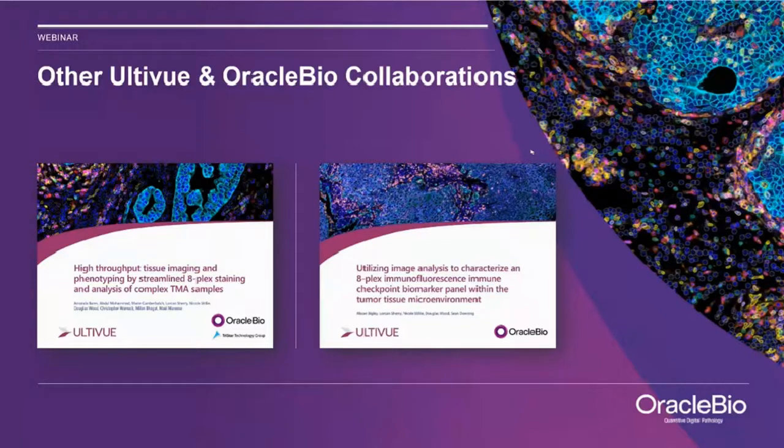Okay, and someone has asked, can I make a multiplex panel with markers that I have validated in IHC? Sure, that's even a better starting point. As I mentioned, we always start from DAB. So if someone has already worked with a specific antibody that works on paraffin samples and has already optimized conditions, this is a good starting point. But all the antibodies that work on paraffin samples and work with regular standard IHC can be used in our assays.